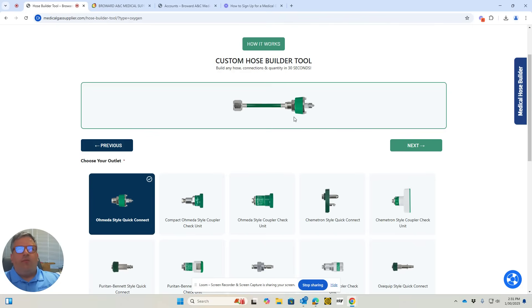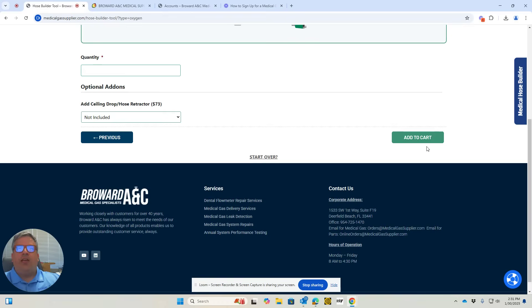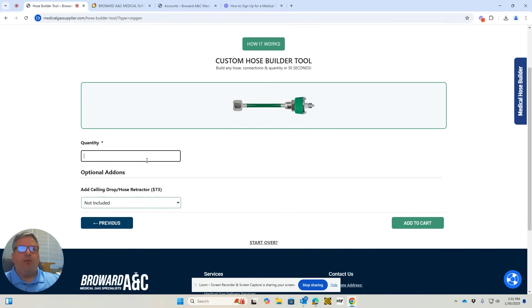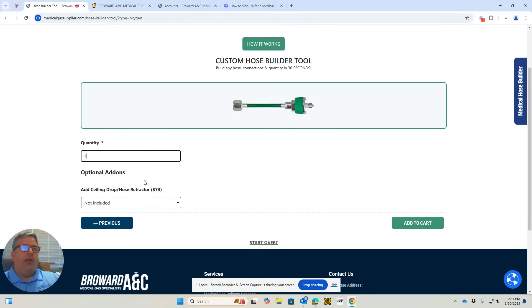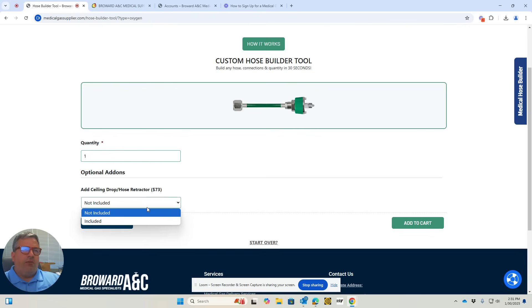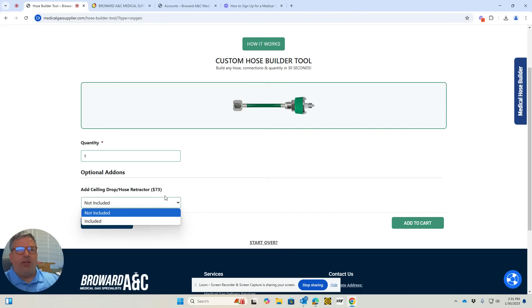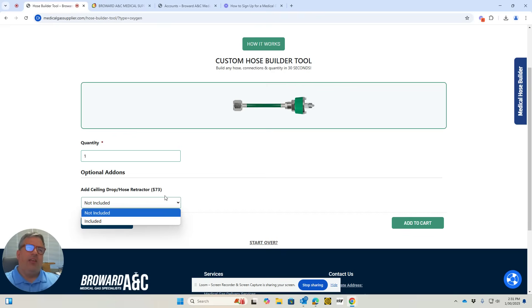you hit next again and put your quantity. Here is an option for most surgery centers. If you're ordering a long hose, you'll want to add a ceiling drop hose retractor. It screws into your latch plate assembly of your outlet that's in your ceiling.